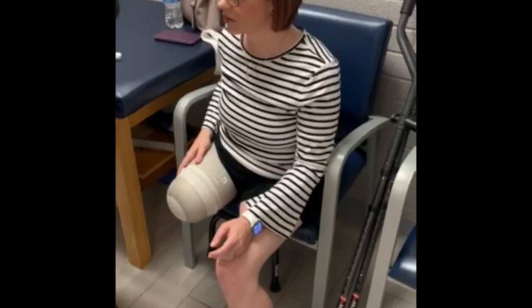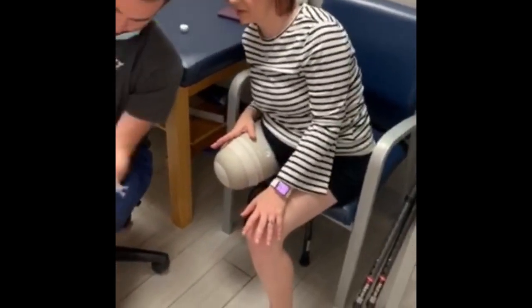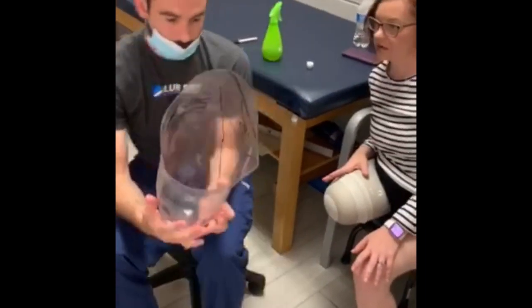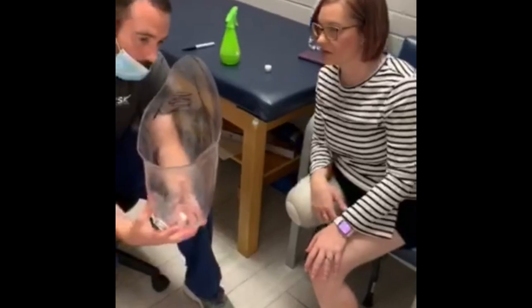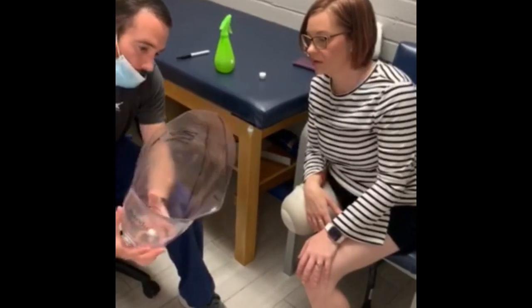So you kind of see my shape here. See how I'm diving in? Yes. That's some of that pressure you were getting right up there in that groin region. But what I wanted to show you, a straight up and down leg would be like that. Your leg kind of hangs like this.